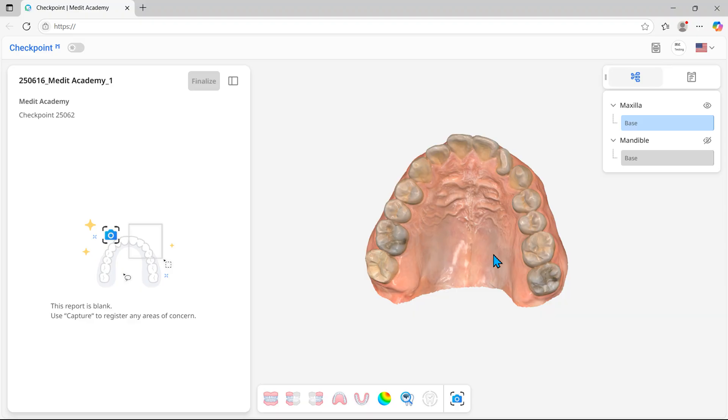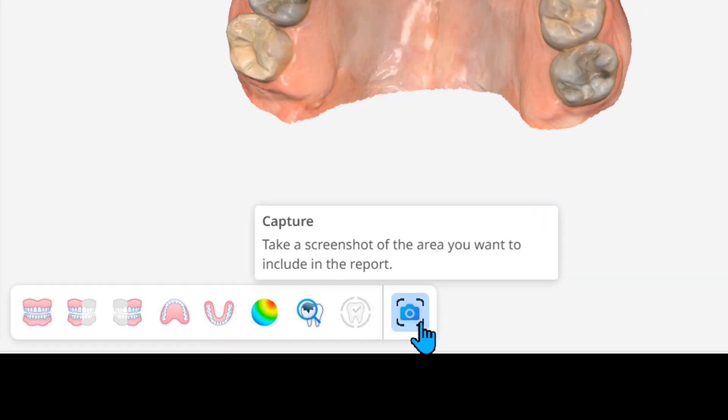Now, let's create a dental report. Capture the areas of concern on the scan.